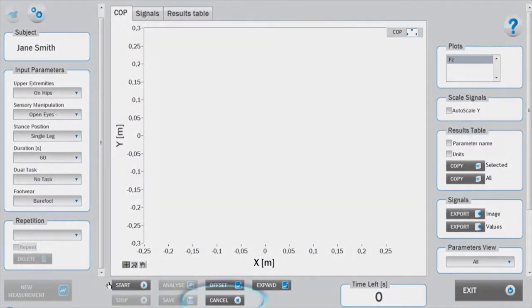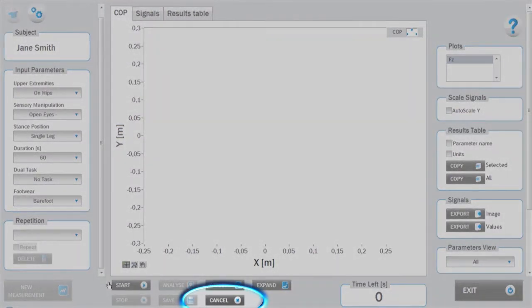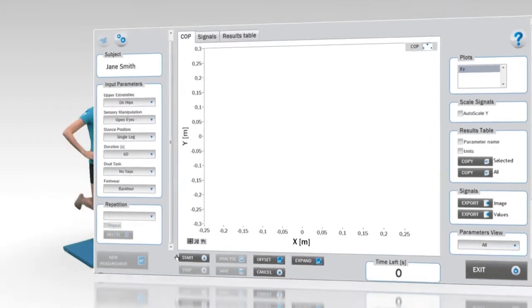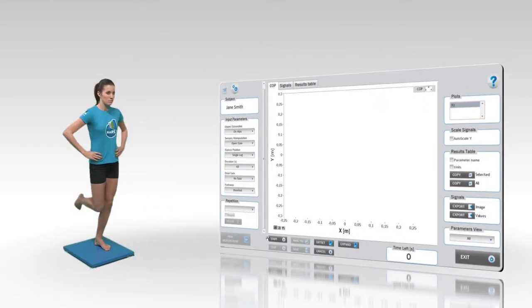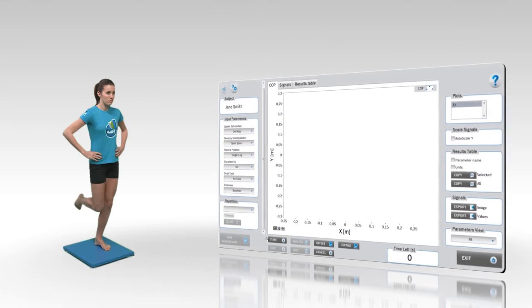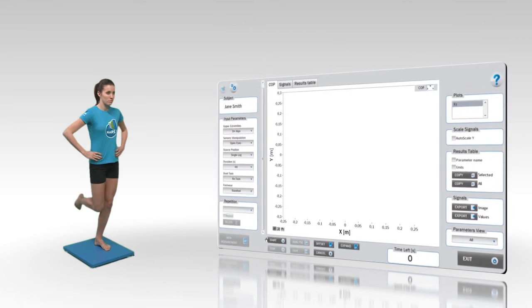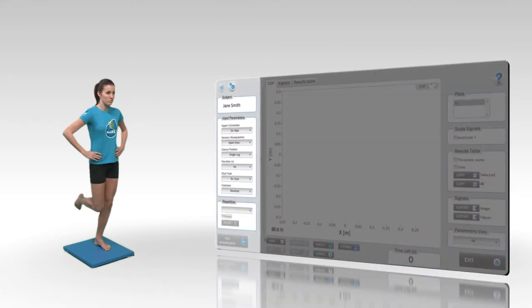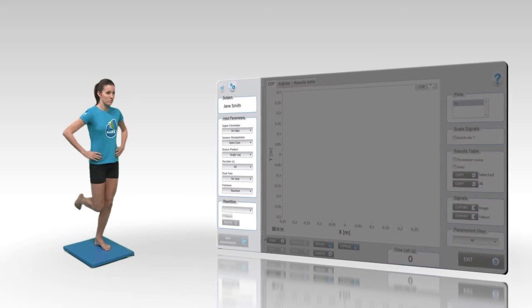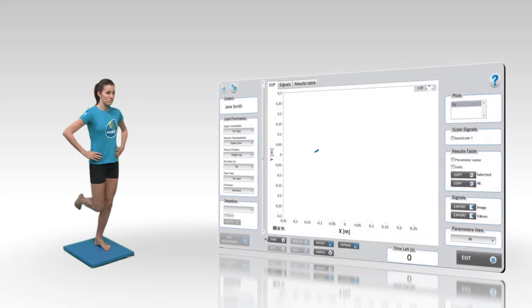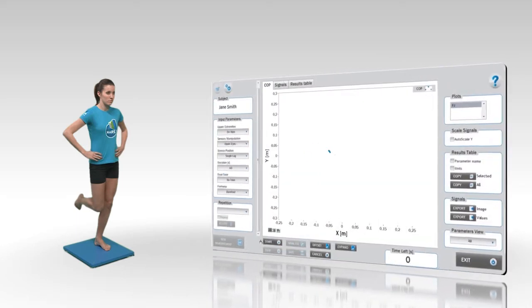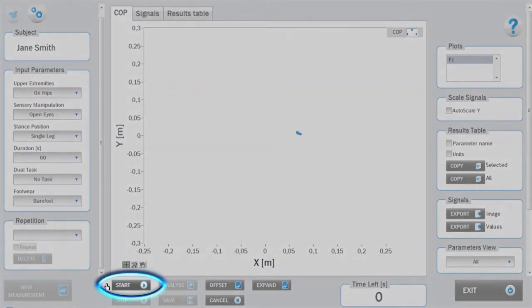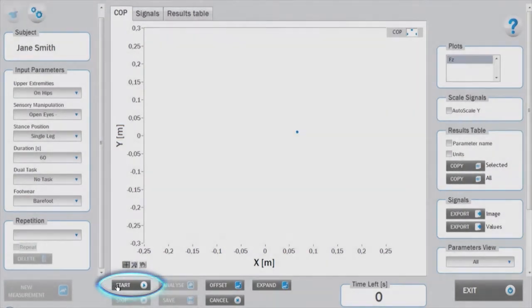Before starting with the measurements, the subject must assume an appropriate initial position which is determined with the input parameter. The goal of the task is to stand as still as possible. Initiate the measurements by pressing the start button.